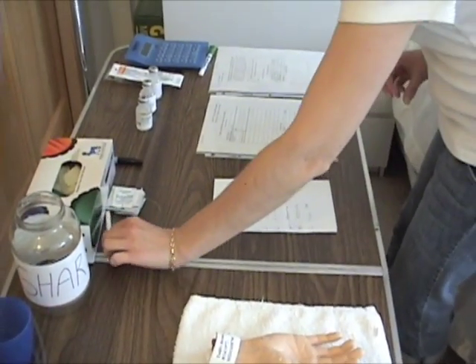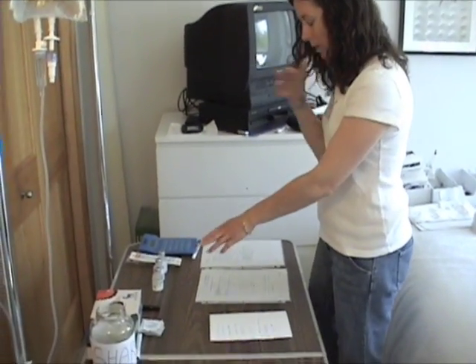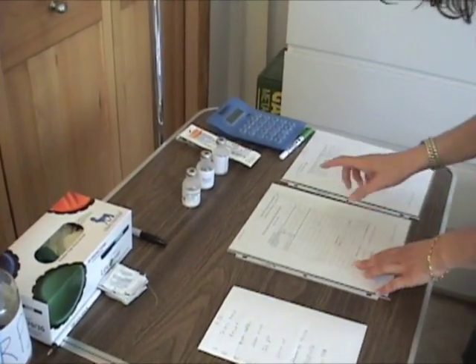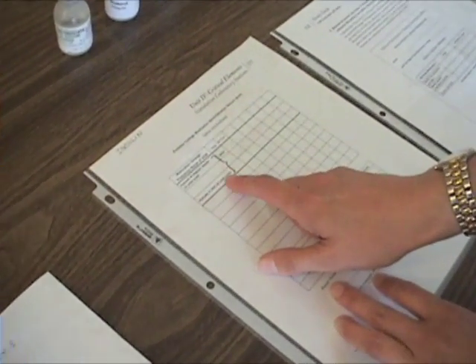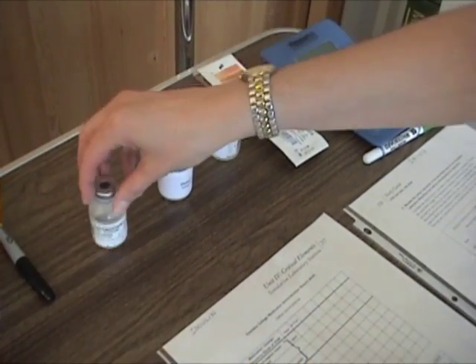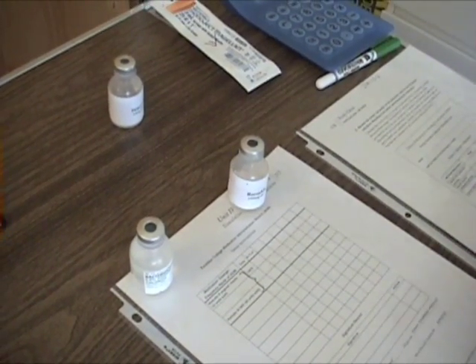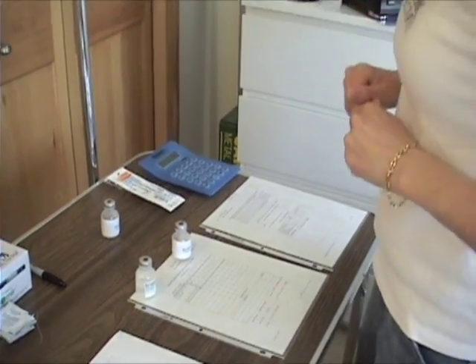Okay, so first thing first, select my medication. So I'm going to have about 4 or 5 vials here, and I need to inject medication A, 1 milliliter, and medication B, 1 milliliter. So I'm going to look for A and B. Let's say this is A and this is B. Okay, and once I select my medications, I need to record.